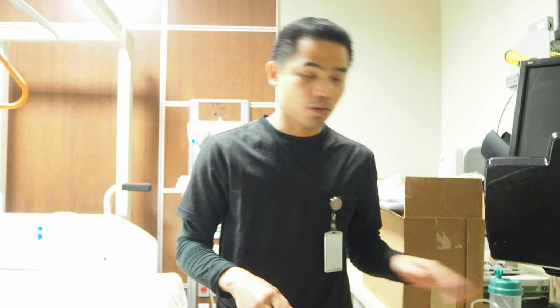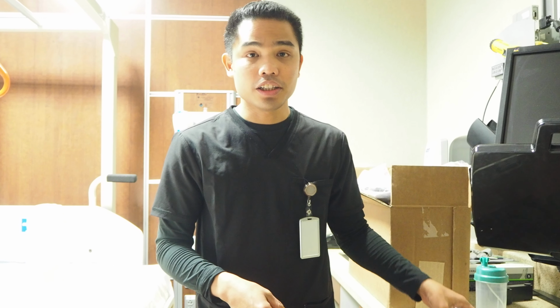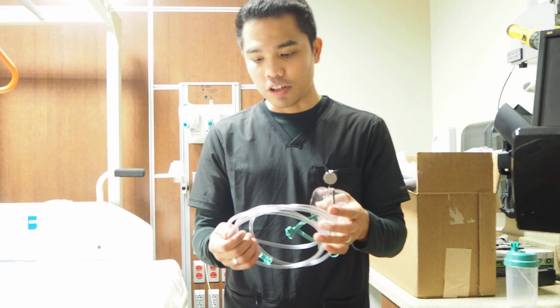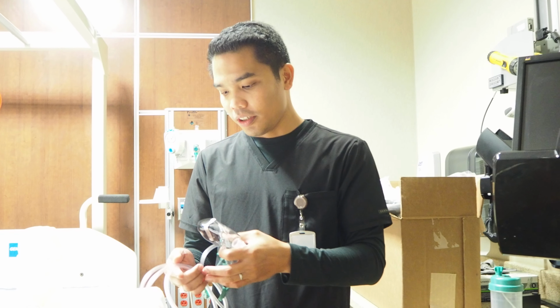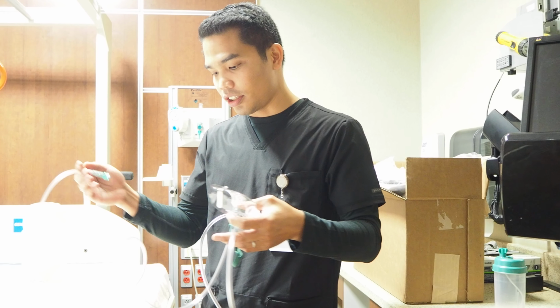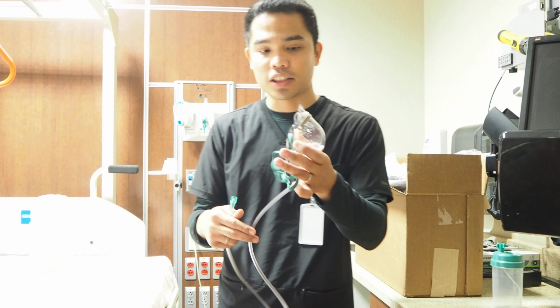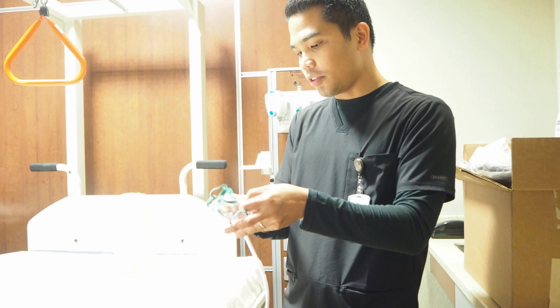I'm going to perform an auto scenario. So I just received a call that there's somebody in the ER who is going to be hooked up with oxygen. So I will immediately go to the emergency room, and then I observed the patient to be lethargic, and then the doctor insisted to be hooked up with a simple mask. So I immediately put this one to the patient, simple mask.